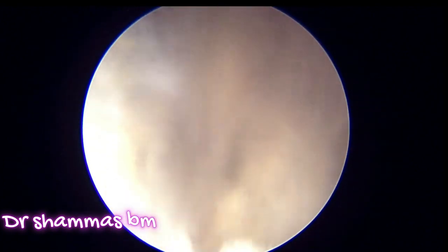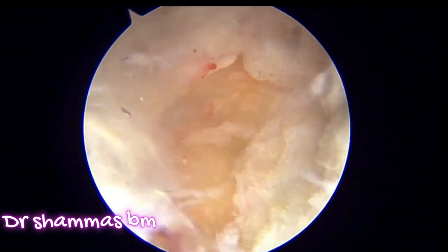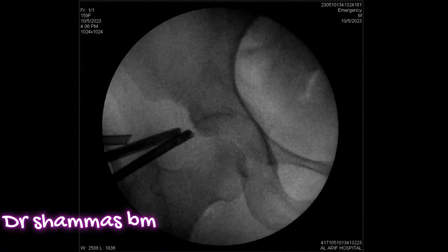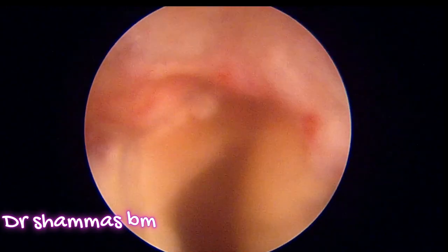Once you are satisfied with the C-arm confirmation, you can proceed to the next step. This is the final C-arm image — you can see that the pincer lesion has been removed. Once satisfied, we move to the next step: the labral repair.